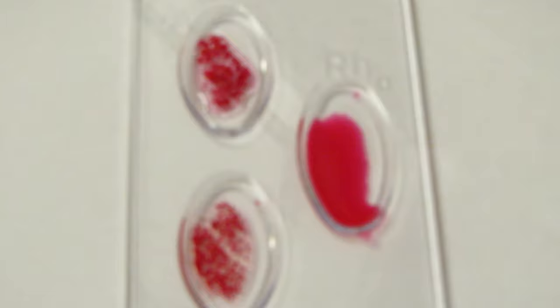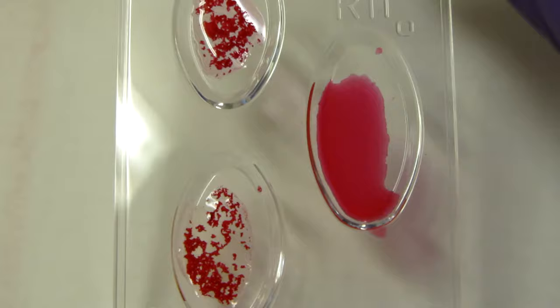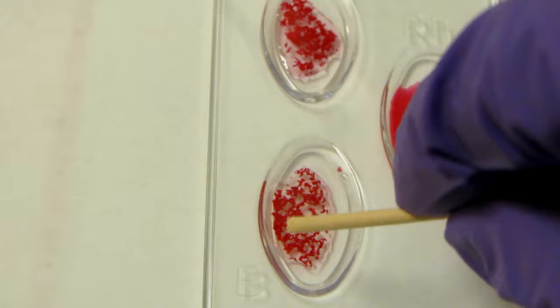Now contrast that to this one: we've got obvious agglutination in the A well, obvious agglutination in the B well, but look at that RH — it's all nice and clear, no agglutination there. So in this case we have AB negative.